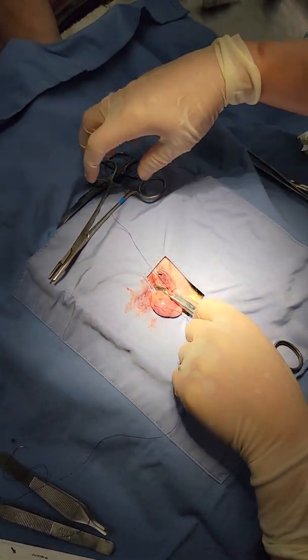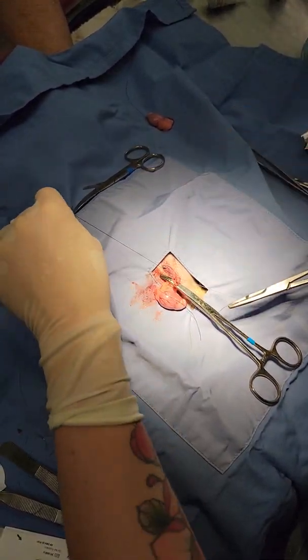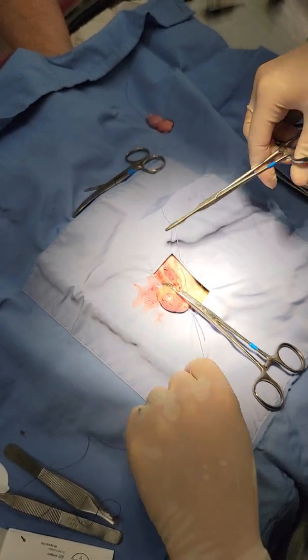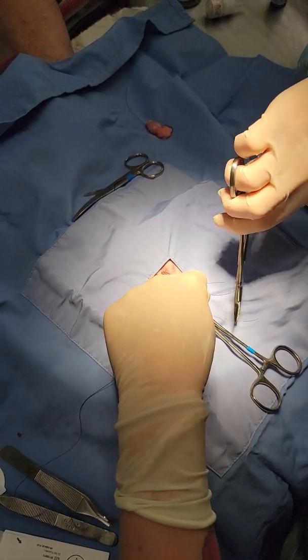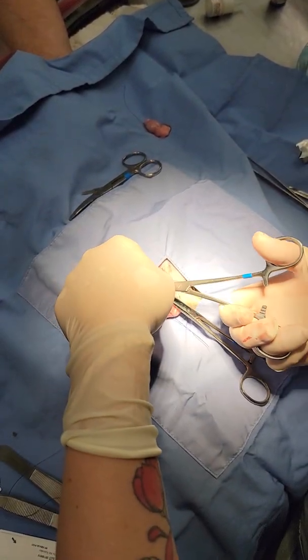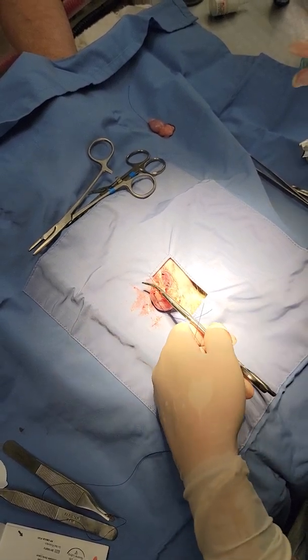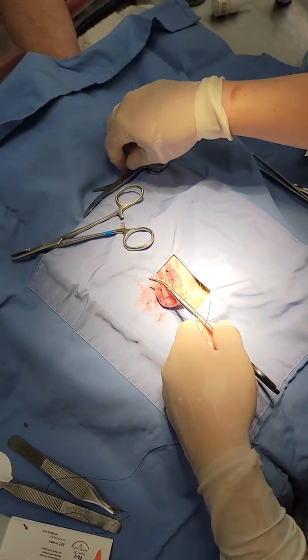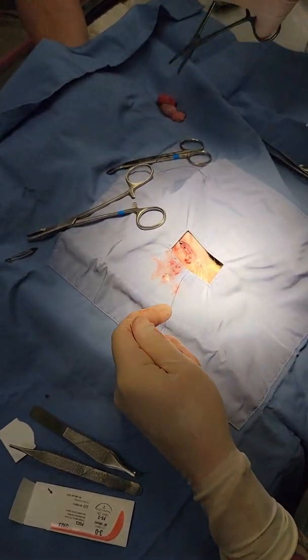You'll find that unlike a dog or a cat, they really don't tend to react as much during the actual ligature. I find that dogs tend to react when I'm actually clamping — these guys don't. It really does tend to be when you're making your body wall incision and when you're closing your body wall incision. I'm going to cut there. There's my second testicle.